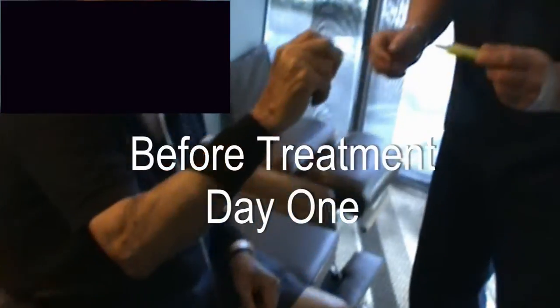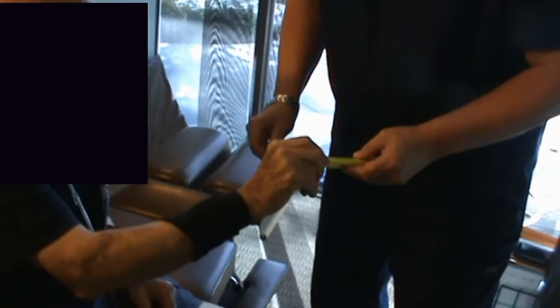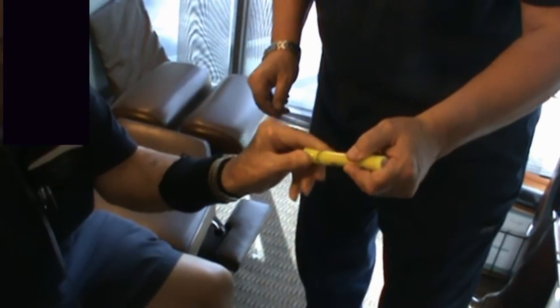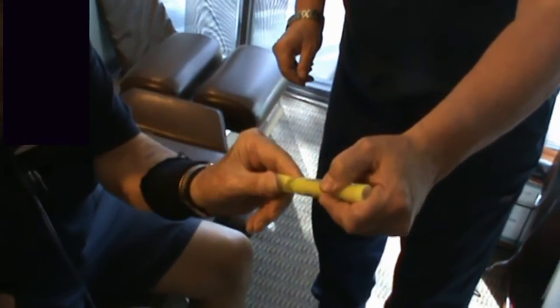Ready? Mm-hmm. So put that on and off for me. Put it on, then take it off, put it on, take it off, put it on. Oh, put it on now. Okay, now try it with your left hand. And take it off, put it on. Take it off one more time, put it on here.